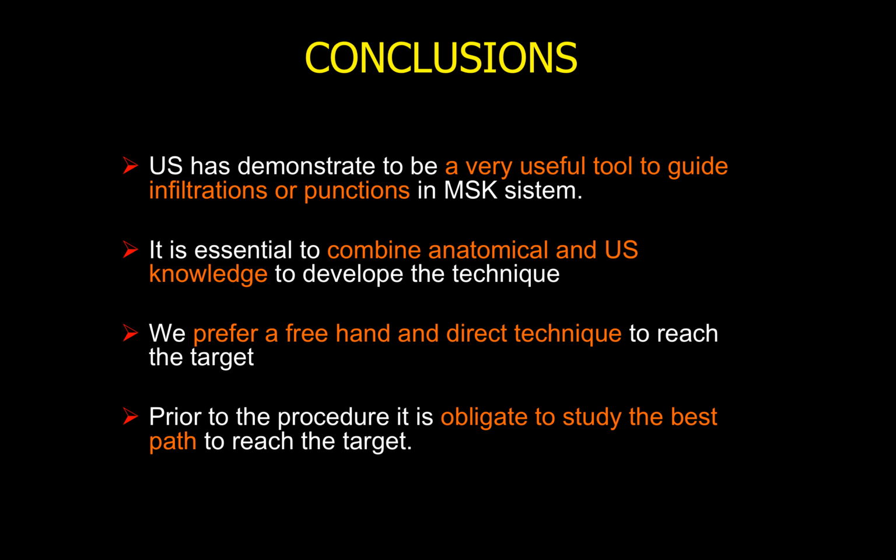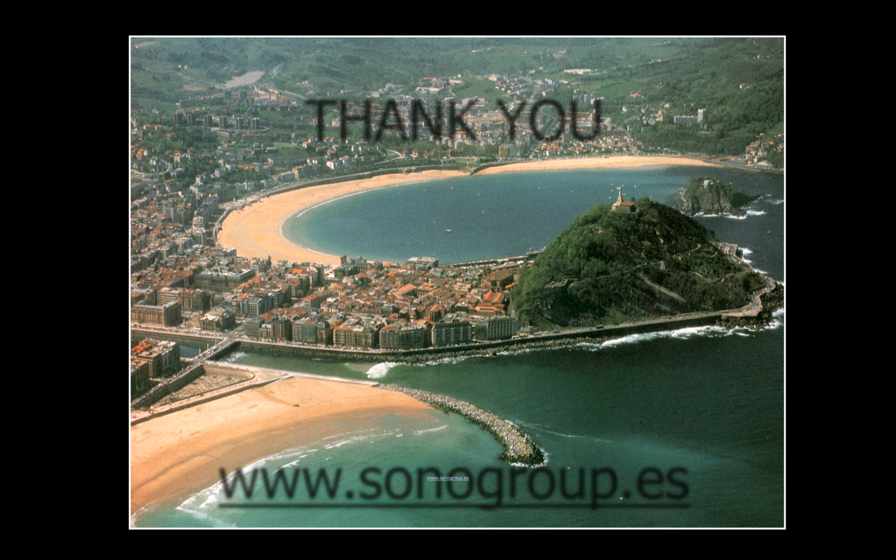We have to plan the target before we make the infiltration, not just when the needle is already inside our objective.